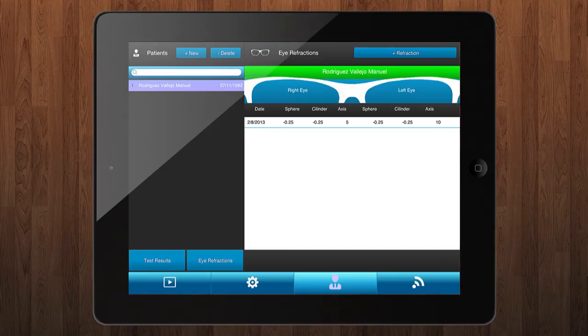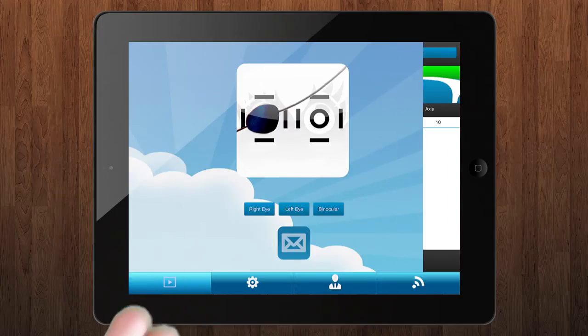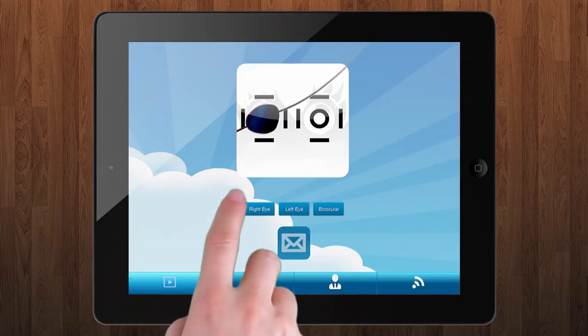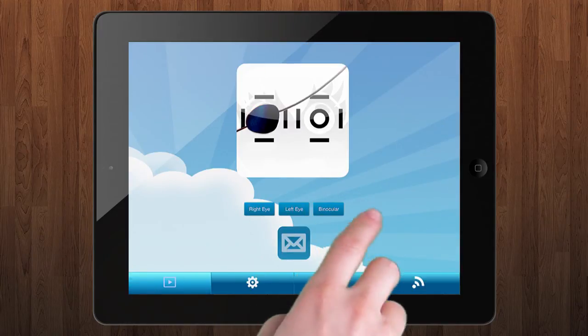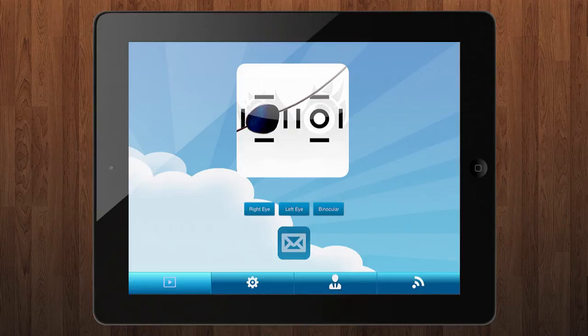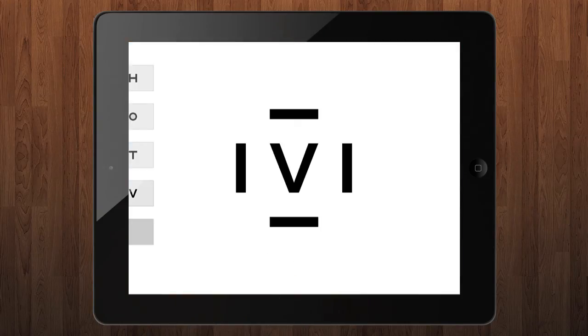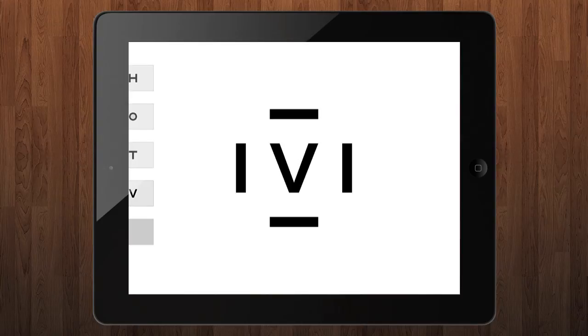At this point you are ready to start the test. Come back to the main screen and press on the button that corresponds to the eye which is going to be evaluated. If you have not changed the default settings, it will start at 0.8 logMAR notation.